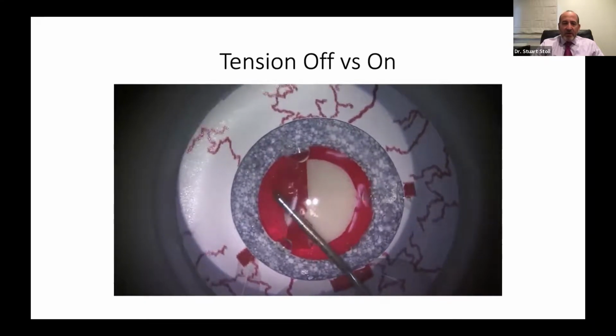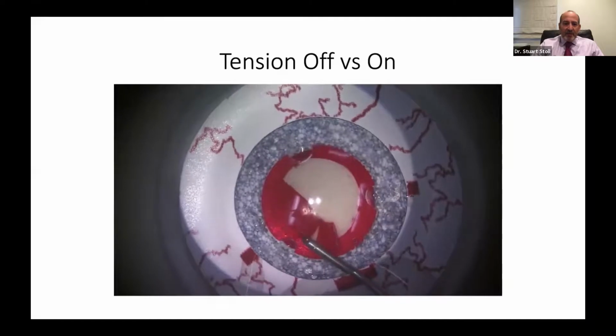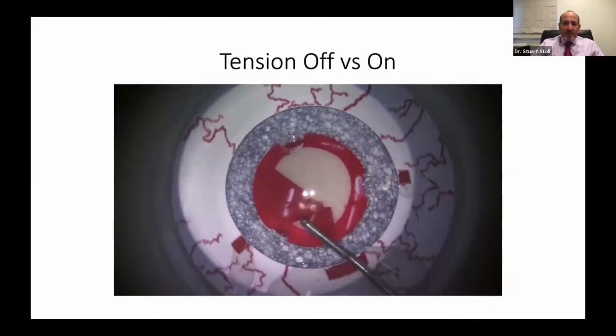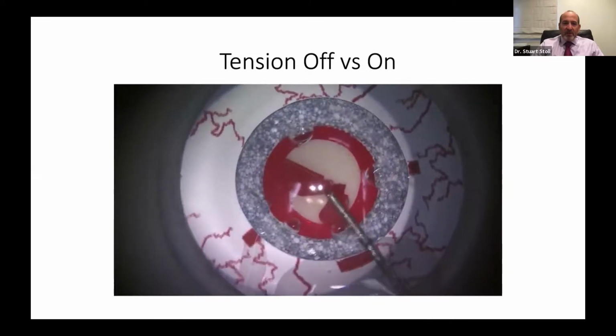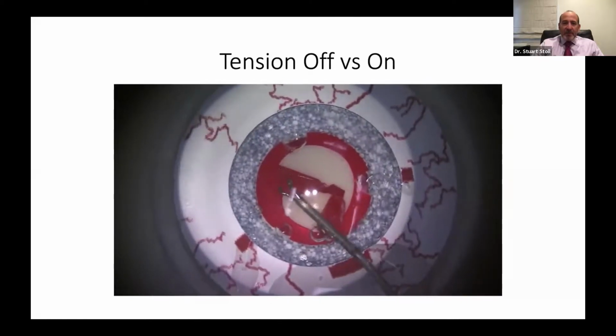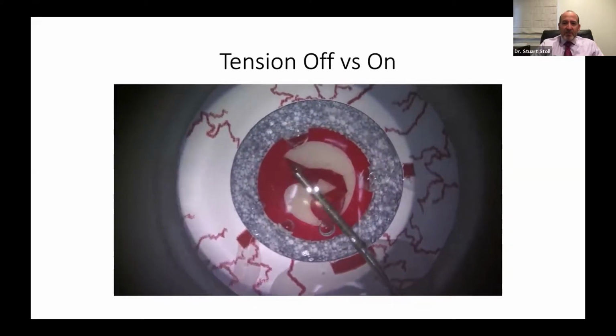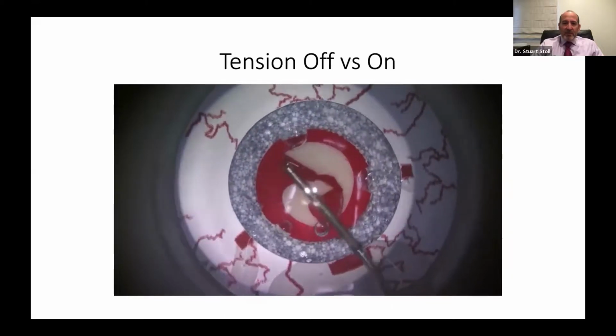We're tension on now. We're opening the capsule. The tips are staying out. We're tracing the point. The capsule's folded over. We got to our 10 o'clock position, reposition the capsule, get it in a nice position to grasp. And I'm going to grasp a little bit too far back, but just for demonstration, we're going to bring those tips right down towards the point of propagation.